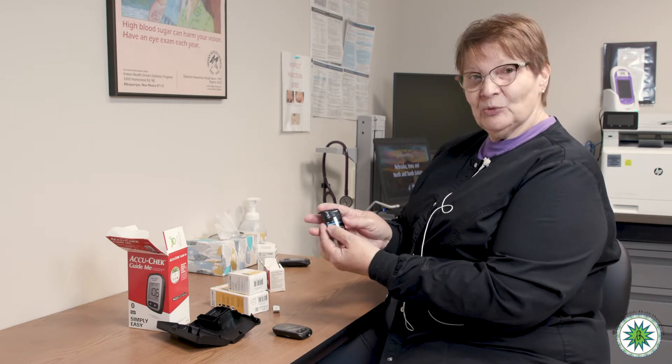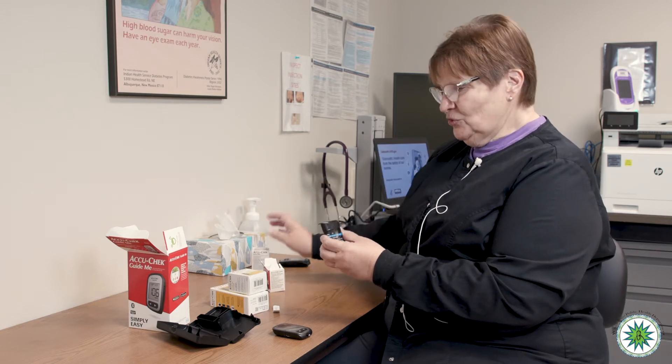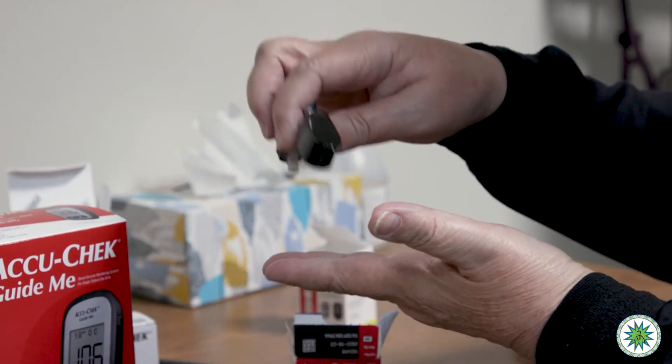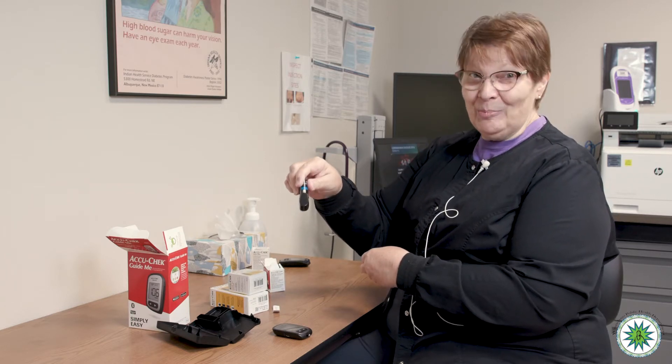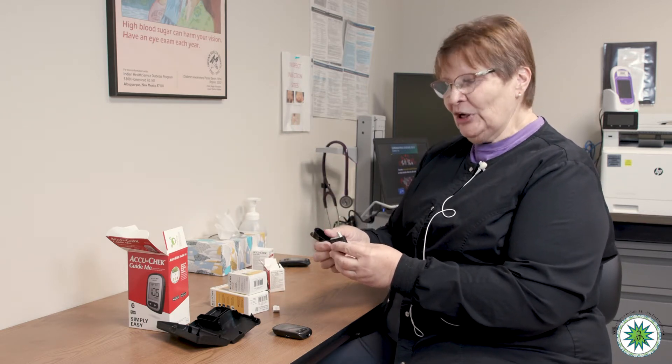This container looks quite different — it's not the round bottle with strips. This is one of the new features: the container pops open and the strips are all lined up. They don't spill out. In the past, opening that bottle meant strips could spill onto the floor and get exposed to dust. So this is a new feature of the strip.